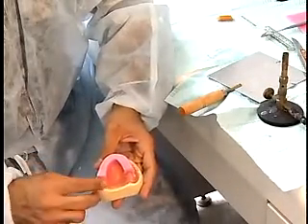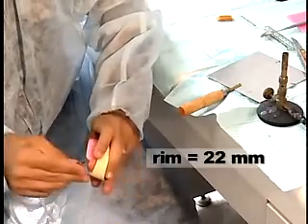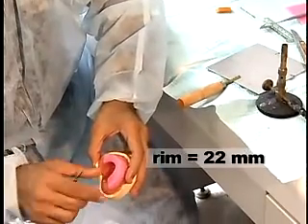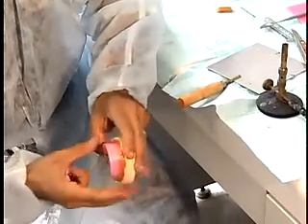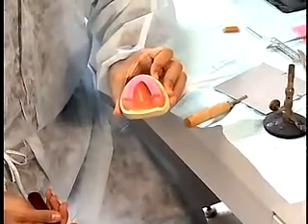Anteriorly, the rim is positioned slightly labial to the residual ridge. The rim will measure 22 mm from the anterior labial border to the incisal edge. The rim must be clean, neat, and of proper dimensions and contour.